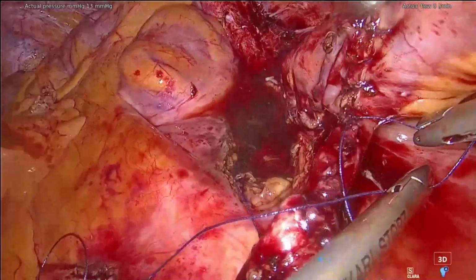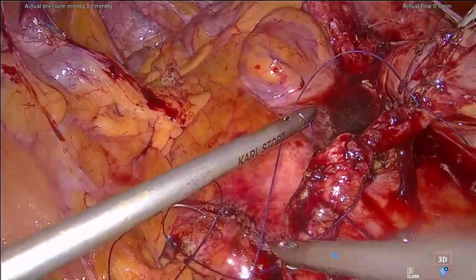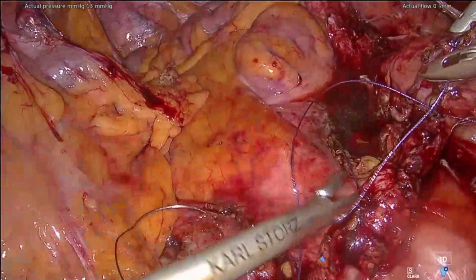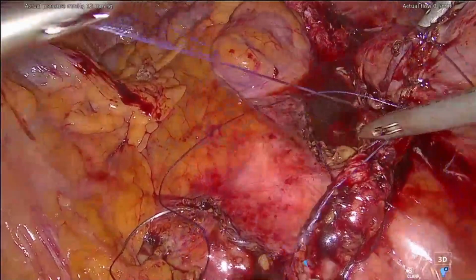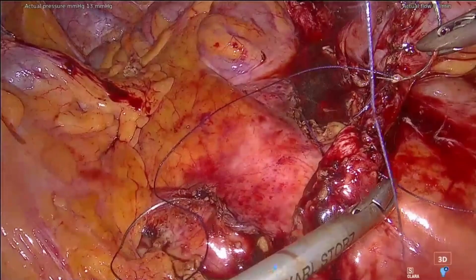Okay, that's it. I cannot forget one detail, which is to close my proximal one, because I still have this one that I've used and is not tight. I have to pass one more time somewhere and just tie to secure it, because I left it suspended after having done one side of the anastomosis of the spatula. Probably with time nothing happened, but I don't like to leave something to hazard.